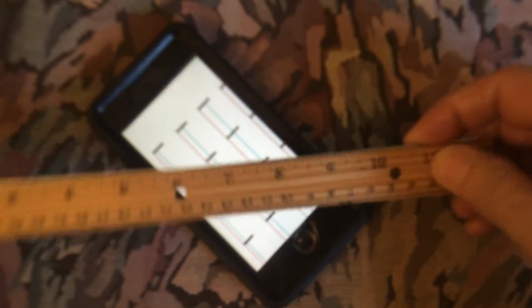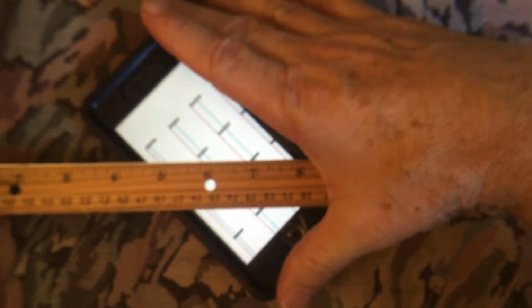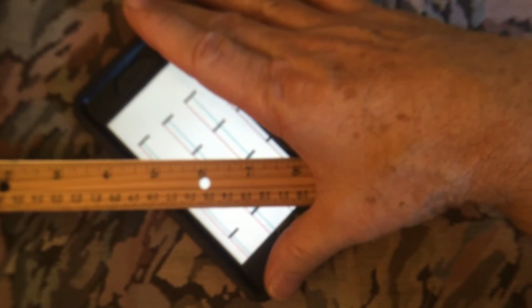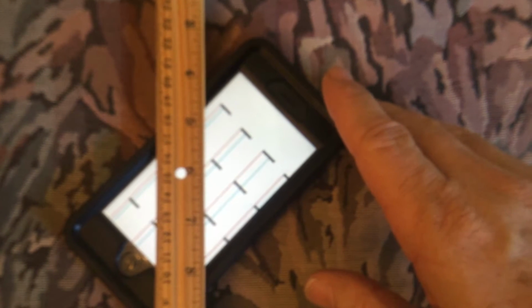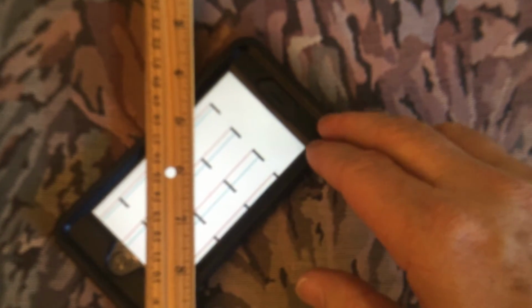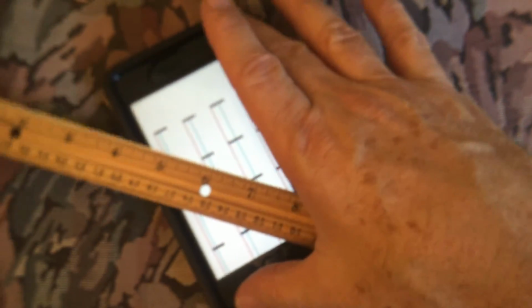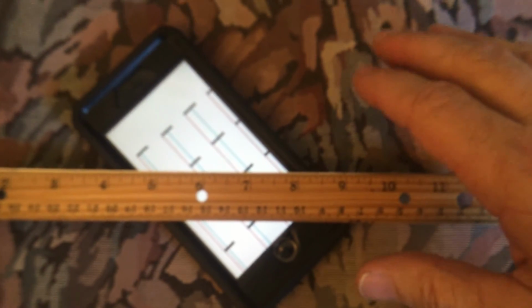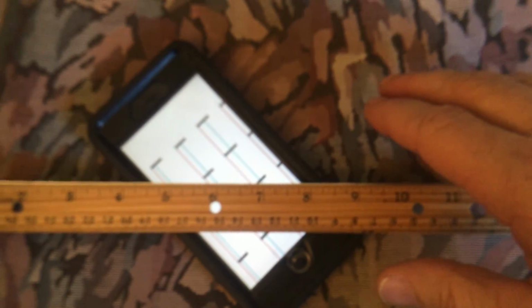We're going to place a ruler below that segment, make a memory of the width of that central white space, and then rotate the phone to make the ruler exactly vertical to you. Again, recognizing that the width has not changed, or is exactly equal between our two visual axes, defines that there's no astigmatism present, and that the refractive error is 2D.